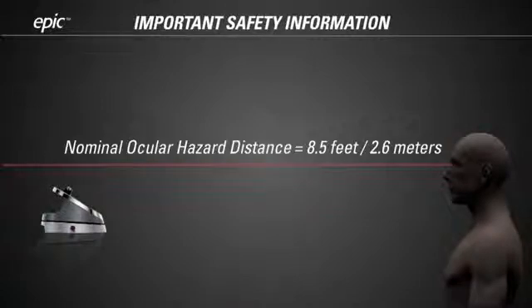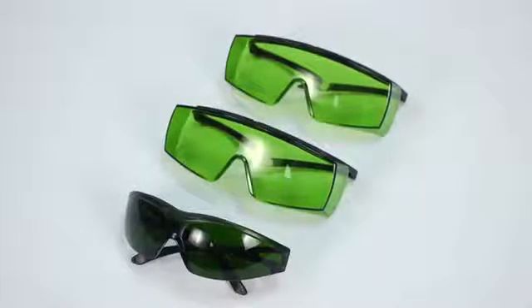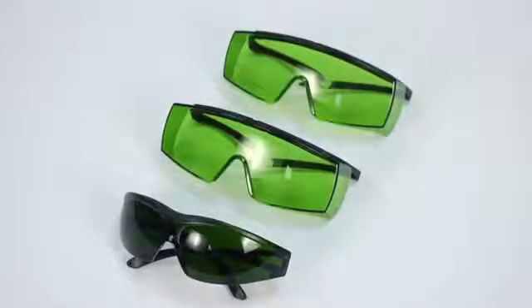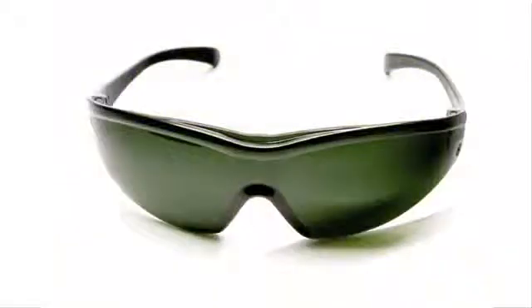Everyone in the room where you use the EPIC laser must wear laser safety glasses. The EPIC system ships with laser safety glasses especially designed to protect eyes from the particular wavelength of the EPIC laser. Using other laser safety glasses, even ones designed to block a similar wavelength, may provide no protection at all. Use only the EPIC safety glasses supplied with your laser, or purchased through Biolase or an authorized Biolase distributor.